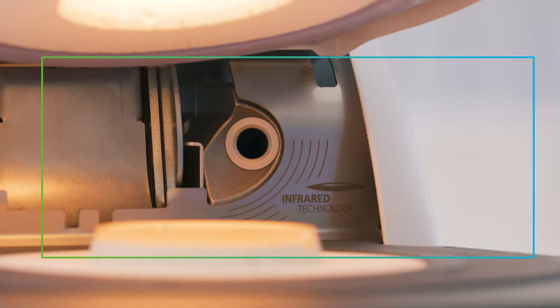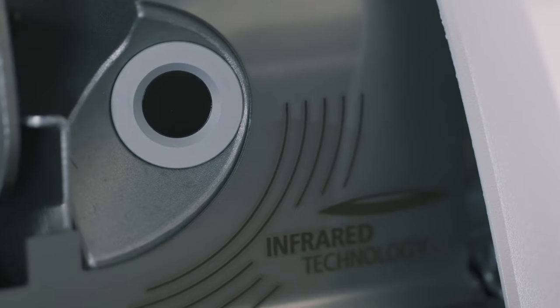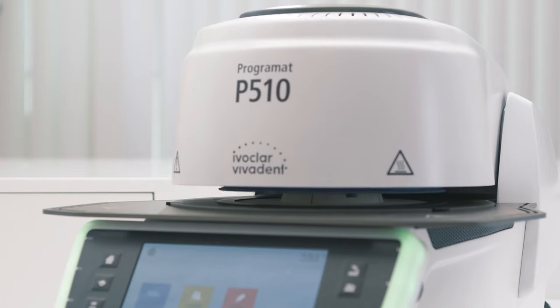Programat Video Tutorial Chapter 5: Introduction to the Programat Infrared Technology. The Programat Infrared Technology can reduce the firing time by up to 25% compared with the firing time of a conventional ceramic furnace.